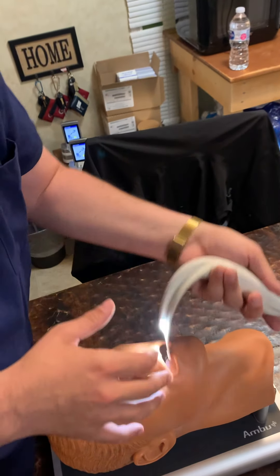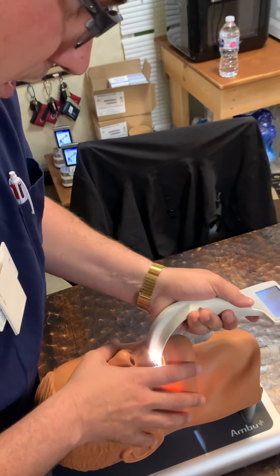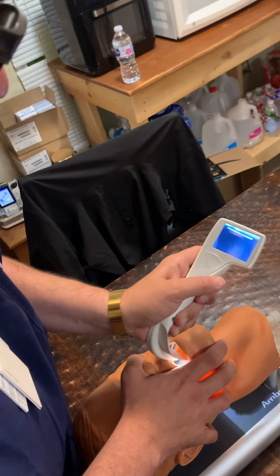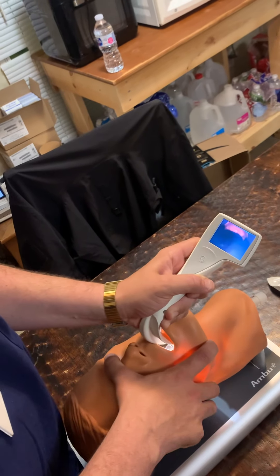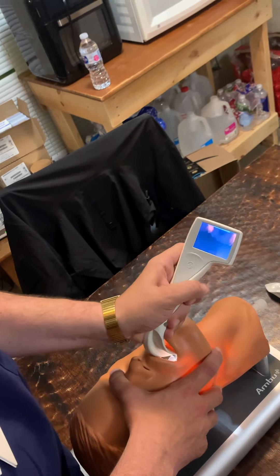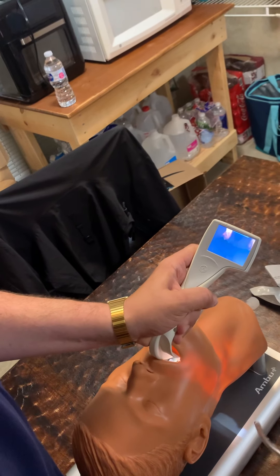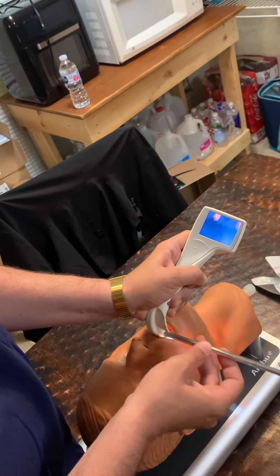I've inserted this while watching it go and touch the tongue. Now I'm going to start looking on the screen — I'm going to find the tongue here. There's tongue. Now I can see epiglottis — you see that epiglottis? Going a little bit further. There's epiglottis still. Go a little bit further. Boom — vocal cords. You see the vocal cords with the posterior arytenoid cartilage. Now I take my ET tube and insert it under direct visualization.